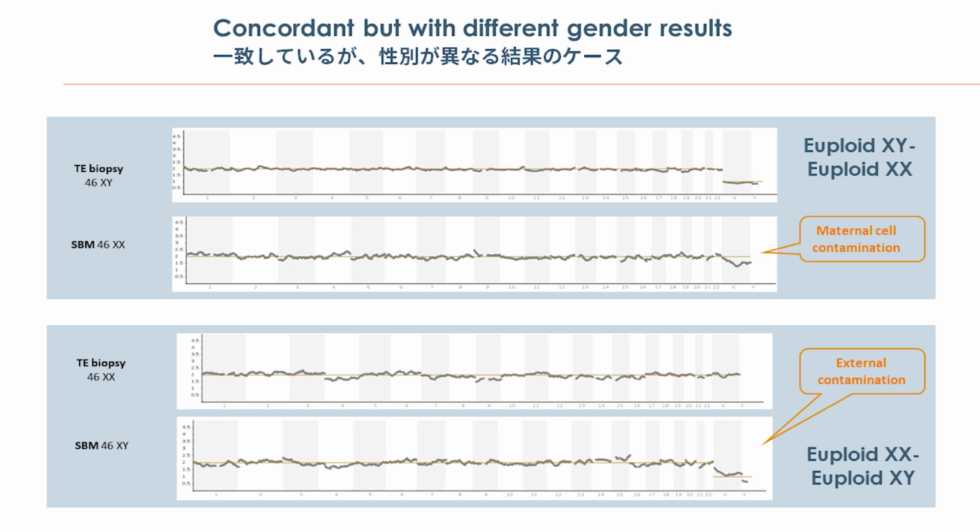So it's very important to work in sterile conditions in the lab with these cases to avoid contamination from skin cells, from saliva cells, and from touching the tips with the surfaces. We just need to work in sterile conditions to try to avoid contamination from the surrounding DNA. The DNA from the granulosa and cumulus cells is a risk, but the DNA surrounding the culture conditions, from the embryologists and the surfaces, is also very important. So understanding this and paying attention to these potential sources of contamination, we can really improve the results very much.